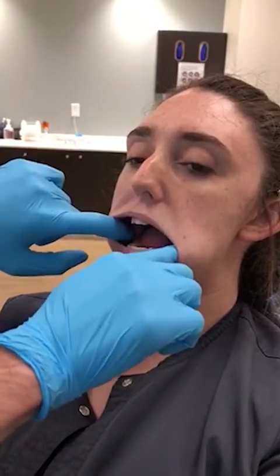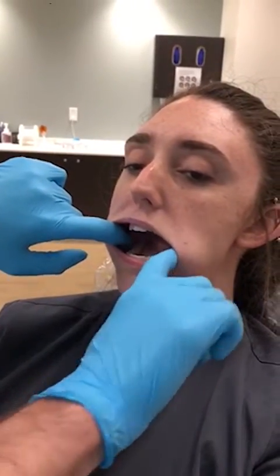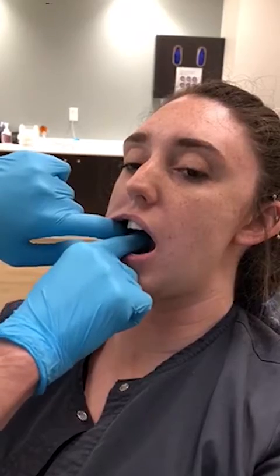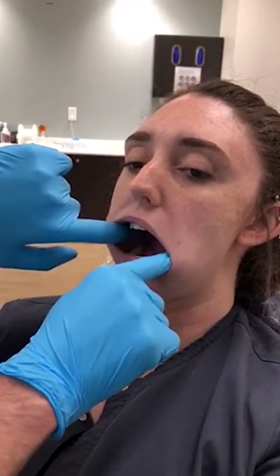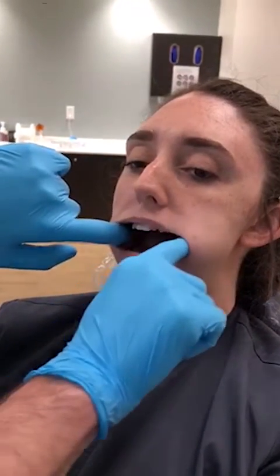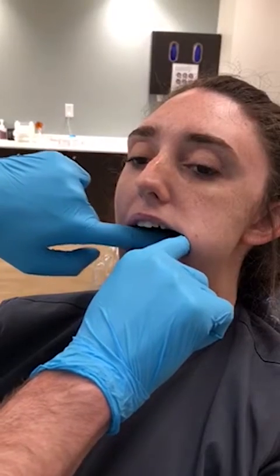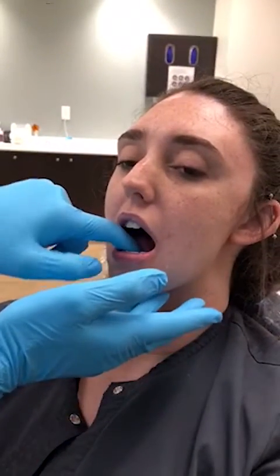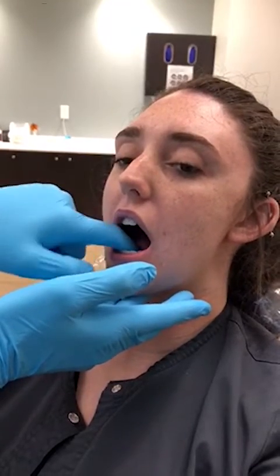I'll then usually have the patient put her tongue in her left cheek. We can see the right lateral surface of the tongue and floor of mouth. The tongue then goes to the other side to allow us to see the contralateral side. I usually palpate during the exam as well, particularly in areas that are amenable to it.